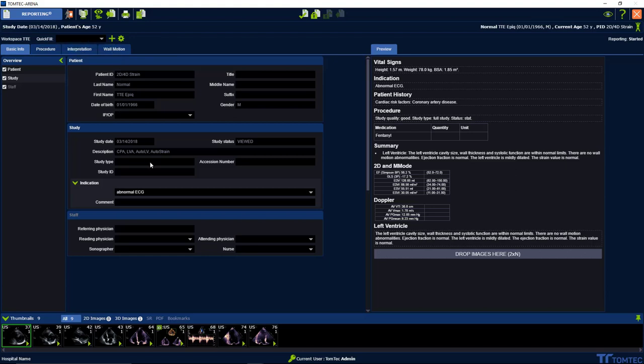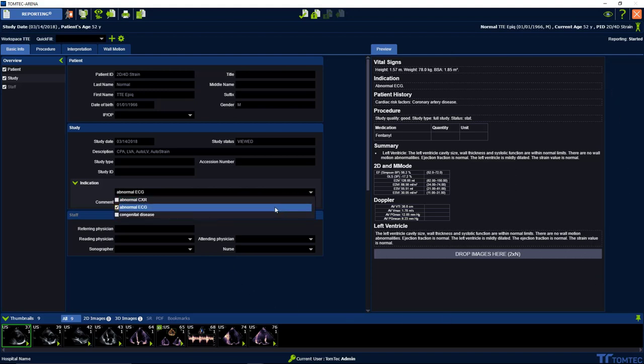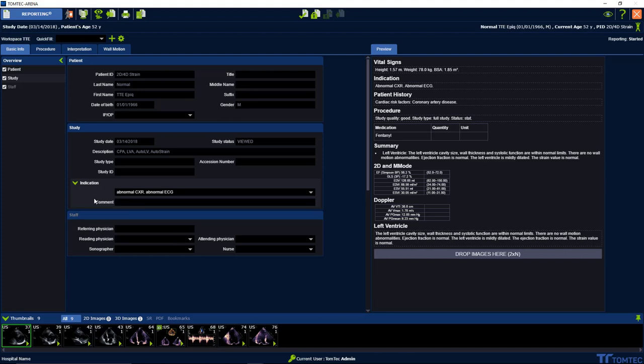On the right side you can see the dynamic preview. Content is filled up by choosing something from the drop downs, either typing some manual comments, as well as from the quick fill submenu.